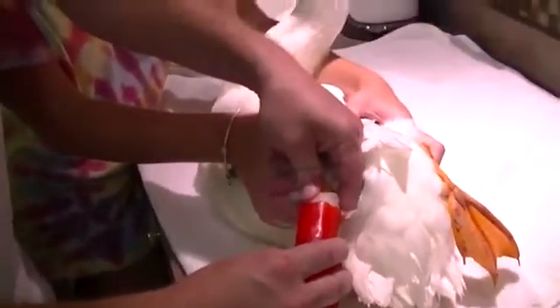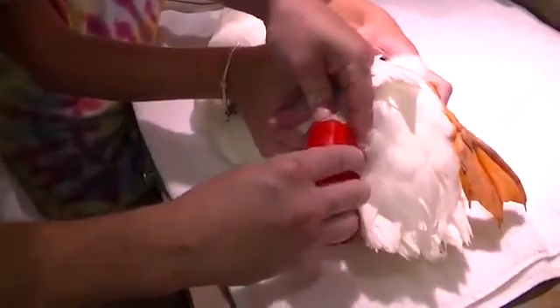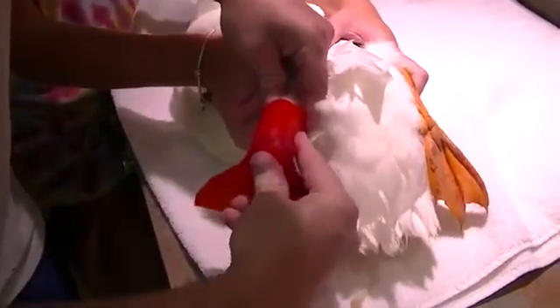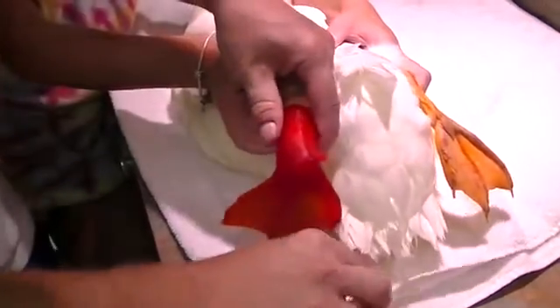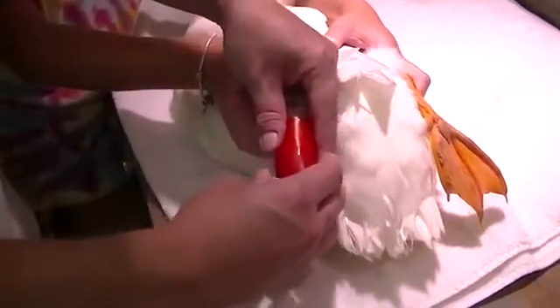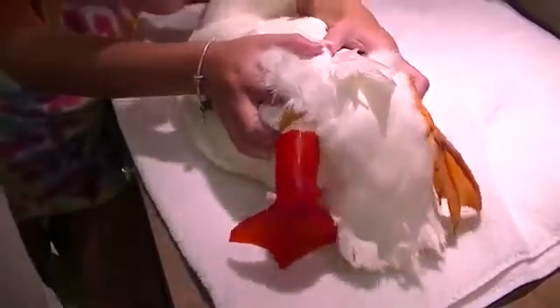Check it. Make sure it's in there good. Looks good. Good boy, Buttercut. I'm going to take him outside and give it a try.